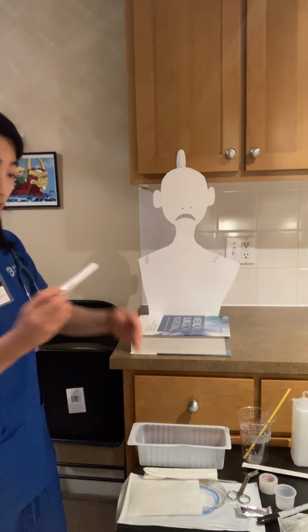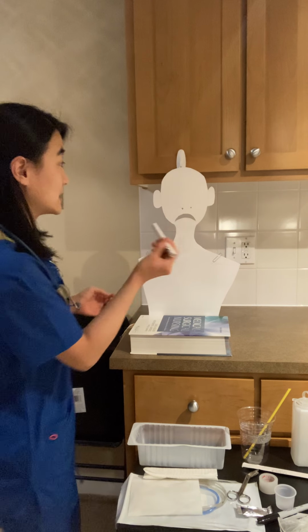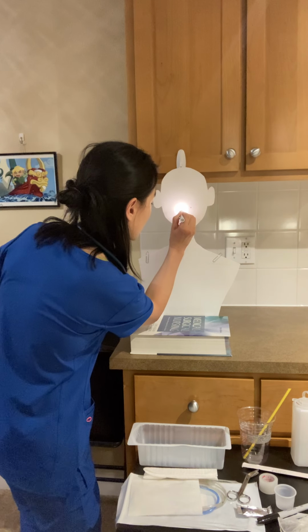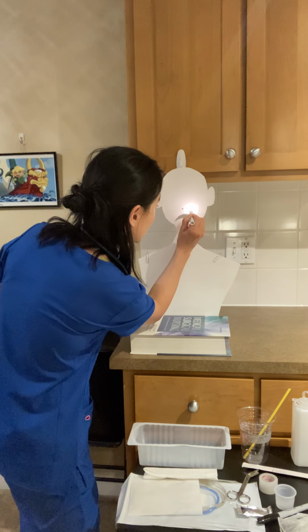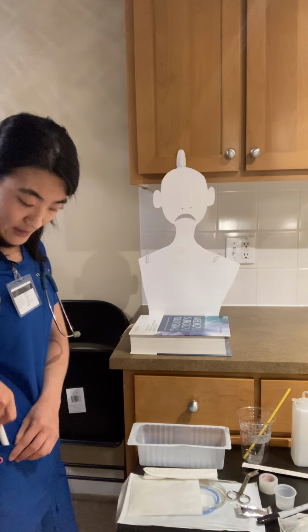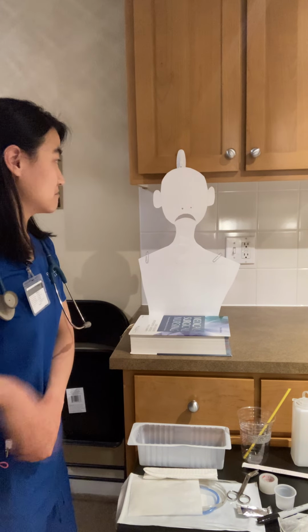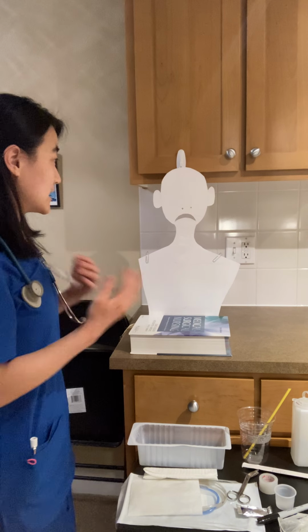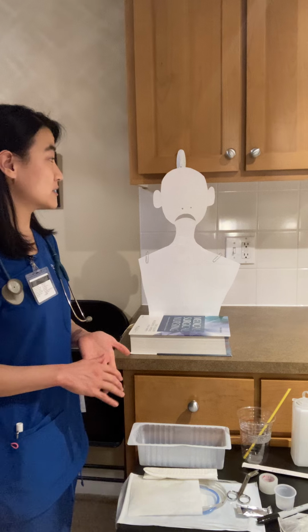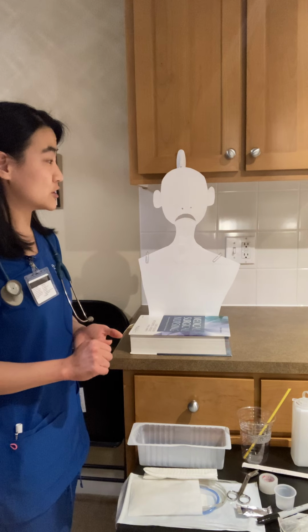I'm also going to examine both his nares and look for any indication of inflammation, obstruction, polyps, anything that can be an obstruction. And I will also verbally confirm with him that he does not have a history of nosebleeds or trauma or surgery to that area.